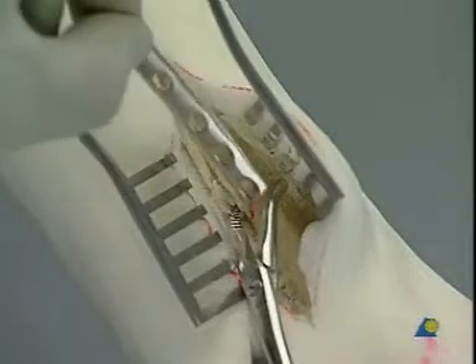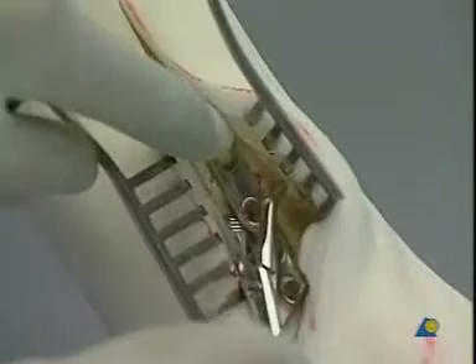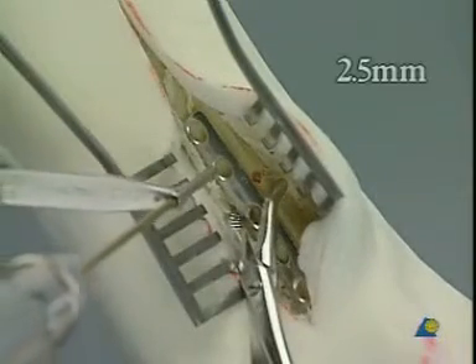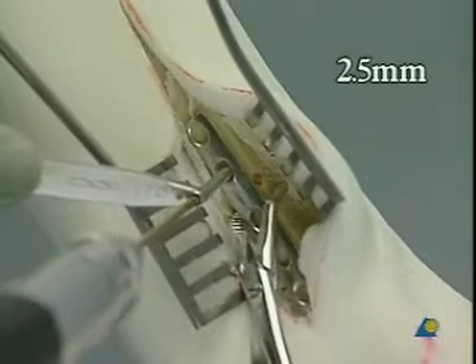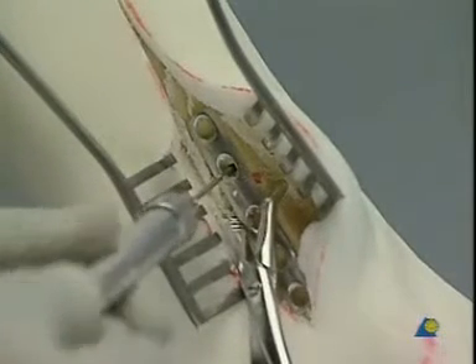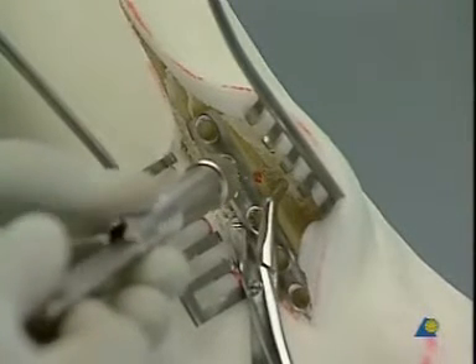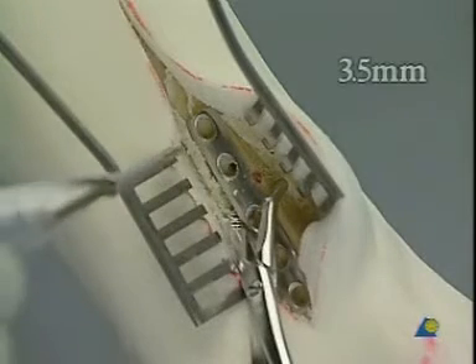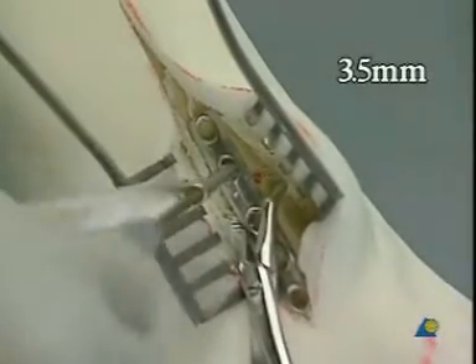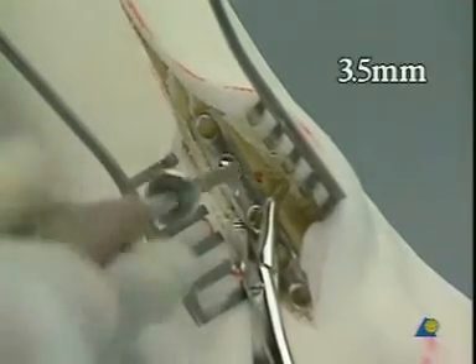A slightly contoured five-hole one-third tubular plate is placed onto the lateral aspect of the fibula, so that the middle hole can accept an interfragmentary lag screw. Drilling with a 2.5 millimeter drill bit and the corresponding drill sleeve. Measuring of the depth. Tapping with the 3.5 millimeter cortical bone tap. A 3.5 millimeter cortex screw is driven home.